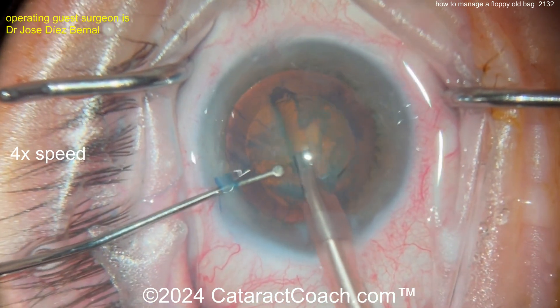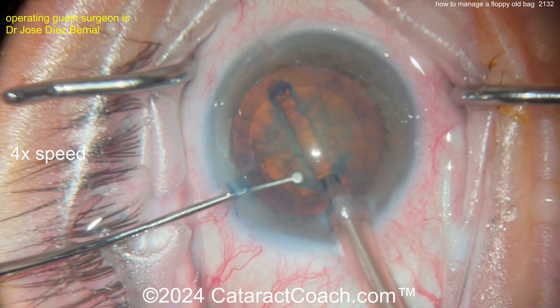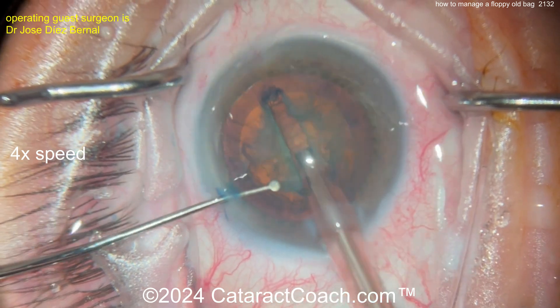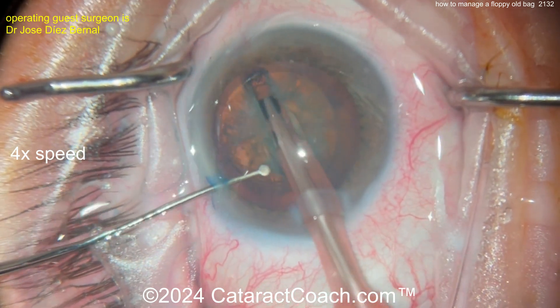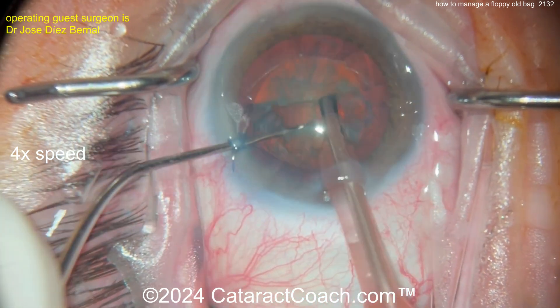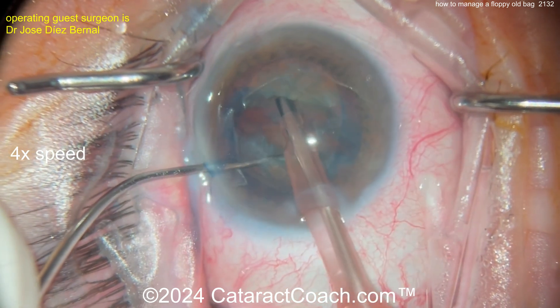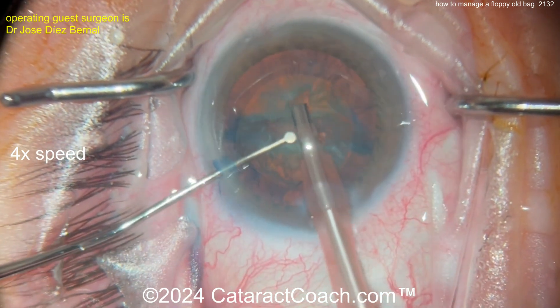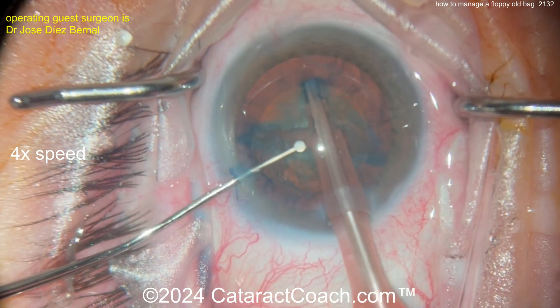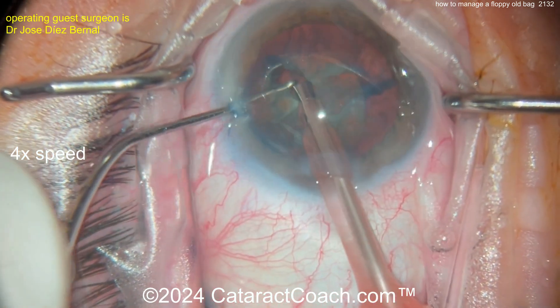Sucking down that anterior capsule. Groove down the middle — maybe stop and chop. I like stop and chop too, that's a good move. Just be very cautious as you split that nucleus. Good grooving down the middle. Now we're going to split it — there's a split. Be careful. Look at that rhexis move — this is stressful. The rhexis is moving. Divide and conquer works too — split that up.